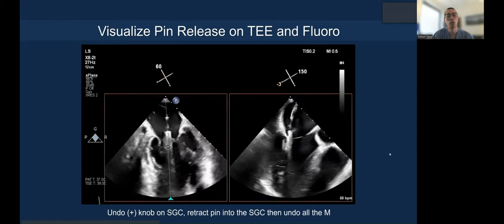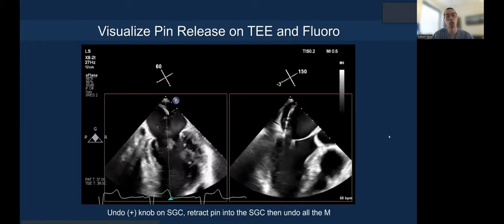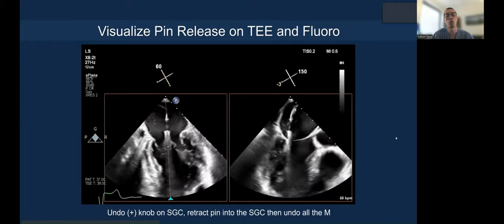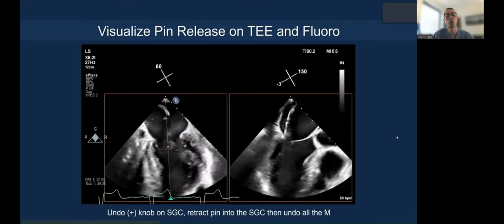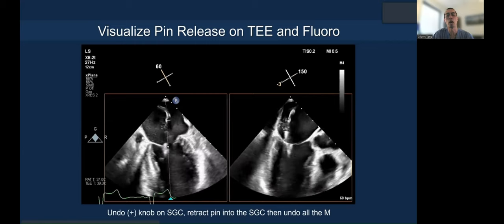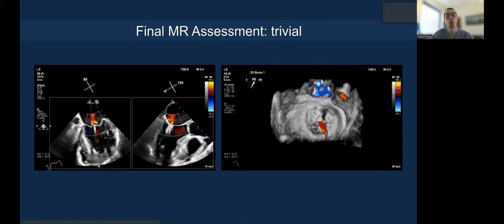We typically undo the plus knob to reduce the tension of the guide, then retract the pin all the way to the guide, then undo all the M. It's not necessary to undo the M right away — you risk swinging out laterally and injuring the left atrium.